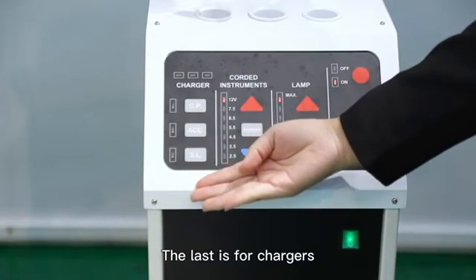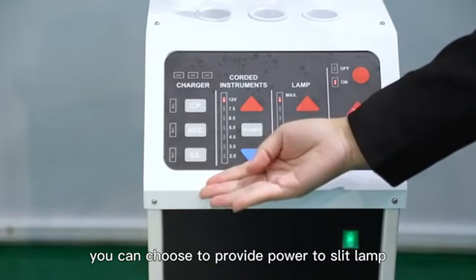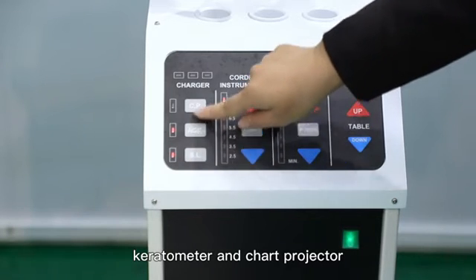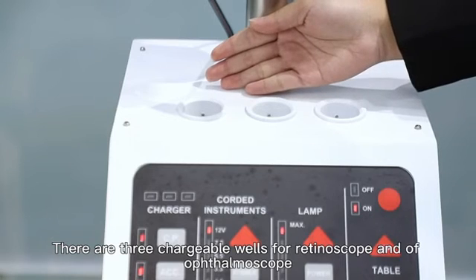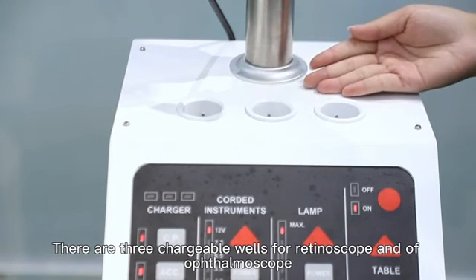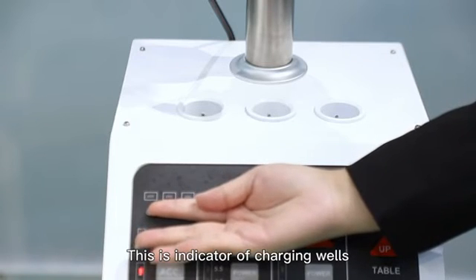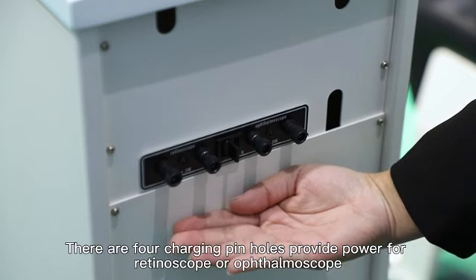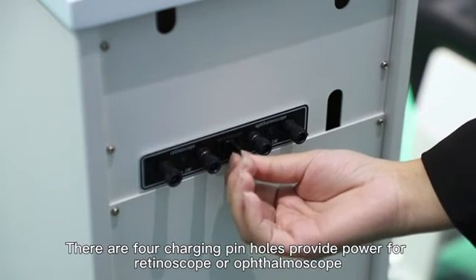The last area is for chargers. You can choose to provide power to the lamp, keratometer, and chart projector. There are three charging wells for ophthalmoscope and retinoscope. This is the indicator for the charging wells. The four charging pinholes provide power for the retinoscope or ophthalmoscope.